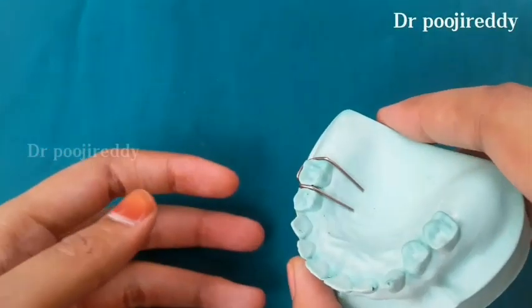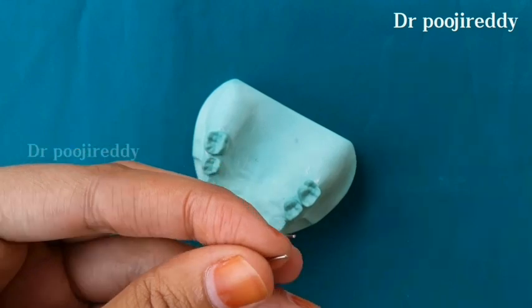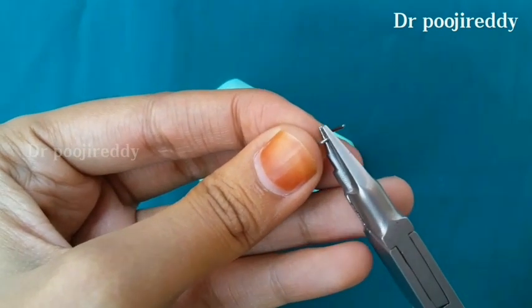Cut the excess of the return arms wire. Finally, pinch out or close in the return arms tip so that it doesn't hurt the soft tissue.